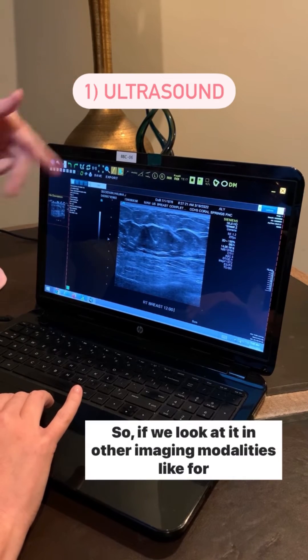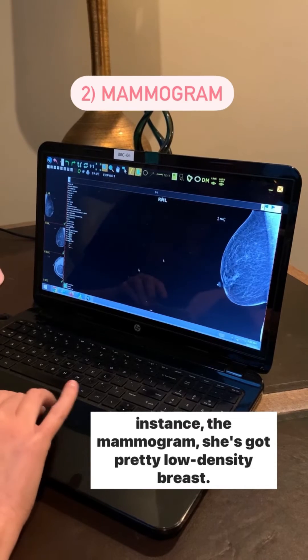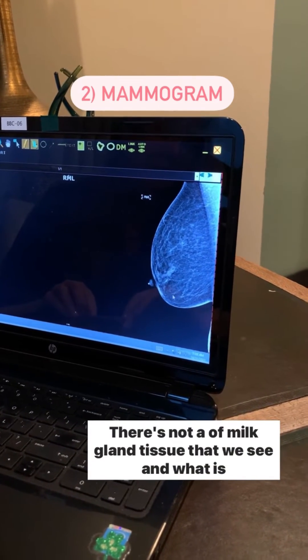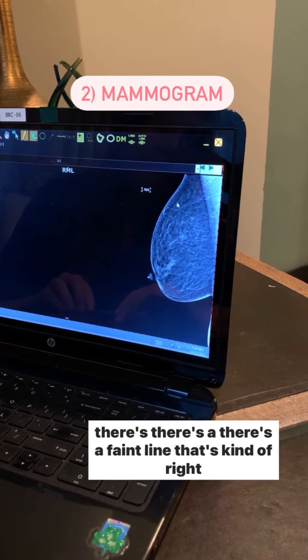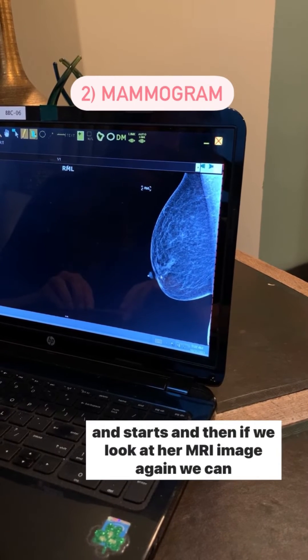If we look at other imaging modalities, like the mammogram, she's got pretty low density breasts — there's not a lot of milk gland tissue that we see, and what is there is very thin and kind of spidery. But you can see there's a faint line right here that's kind of outlining where the breast tissue stops and starts.